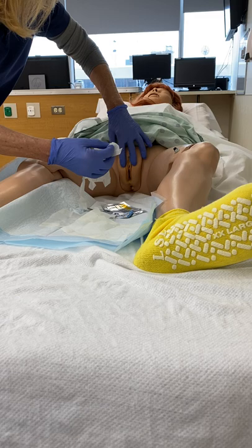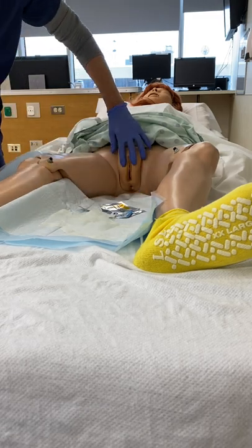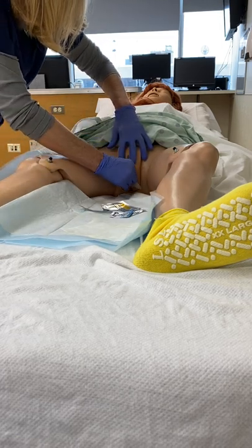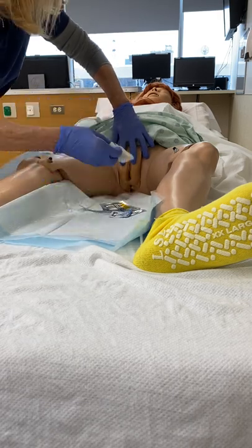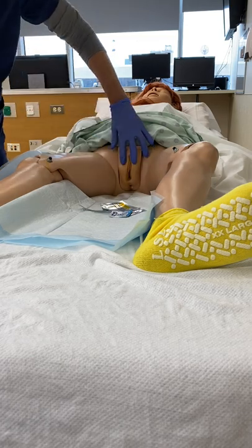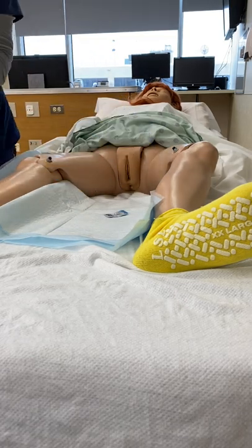Now I'll clean you. First on the right side, top to bottom, and throw it right away. Then on the other side, top to bottom, throw it away. I always tell the nurses not to place it back on the sterile field. Now I'll discard that as well as my gloves.